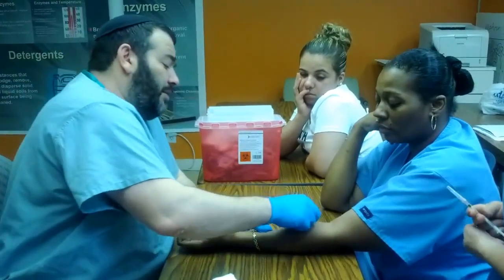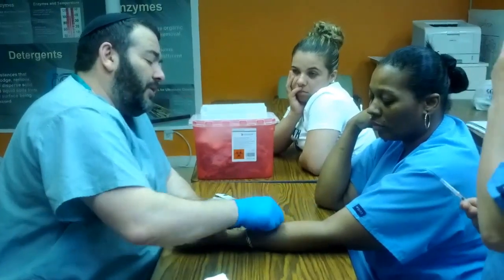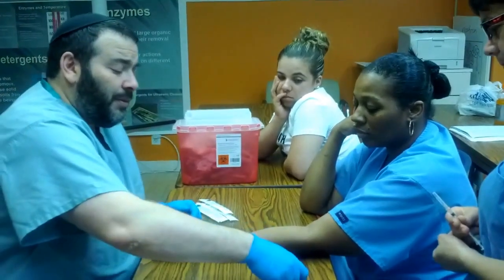Intradermal injection, which is most commonly used for a TB test or tuberculosis test, also known as a PPD. PPD stands for Purified Protein Derivative, okay, and also known as a Mantoux test. As you just saw, I wiped the area clean, and I did it from the middle out.